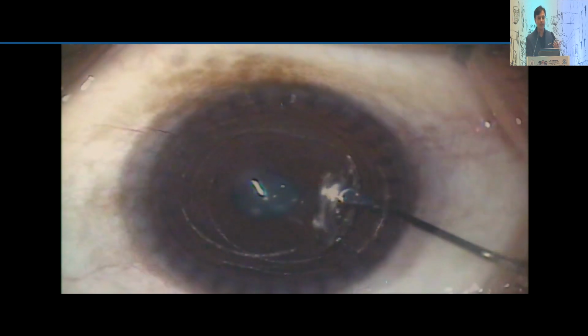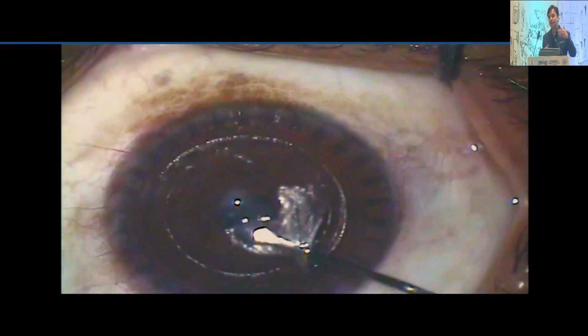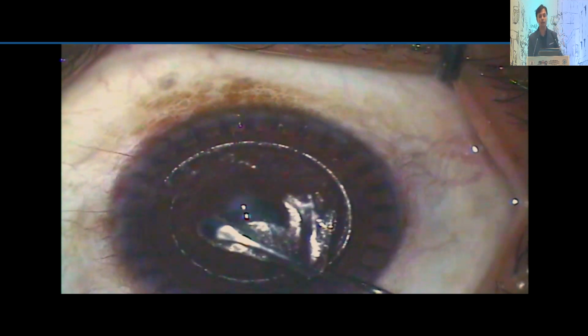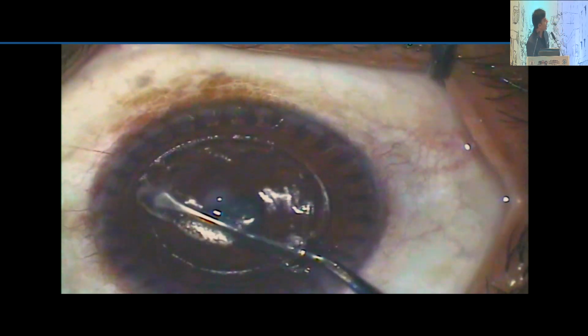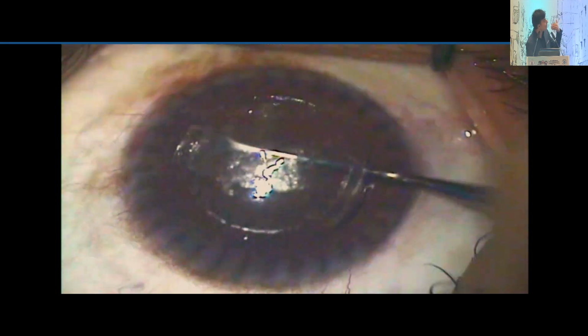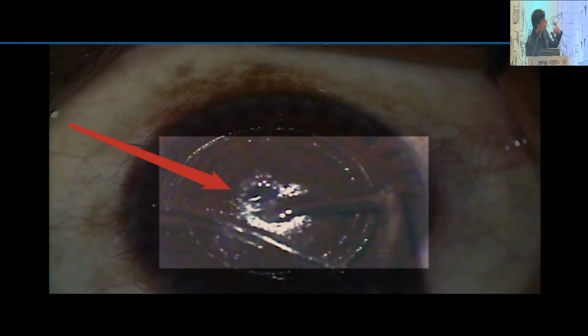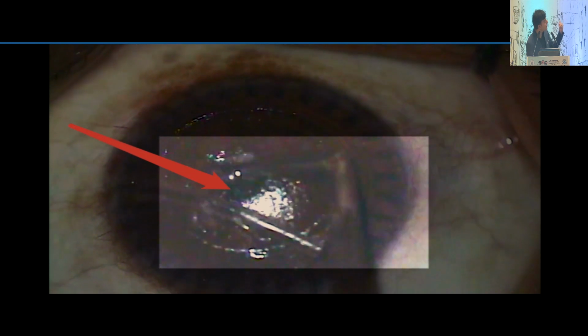One of the most important things that you want in epithelial ingrowth is to have full access so that you can debride the epithelial ingrowth completely, and the way that you can have access is by creating a flap with the help of CIRCLE in which you can now open up the entire lamellar cut, and now you have full access to the epithelial ingrowth. You can use any kind of spatula to debride the epithelial cell nests from over the surface of the stroma and under the surface of the flap as well.